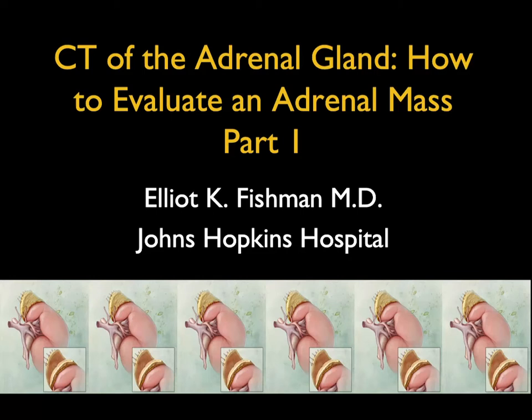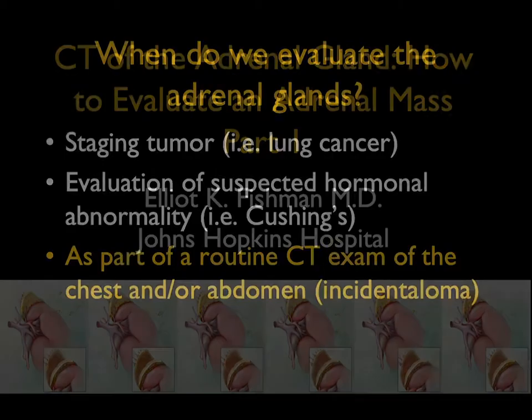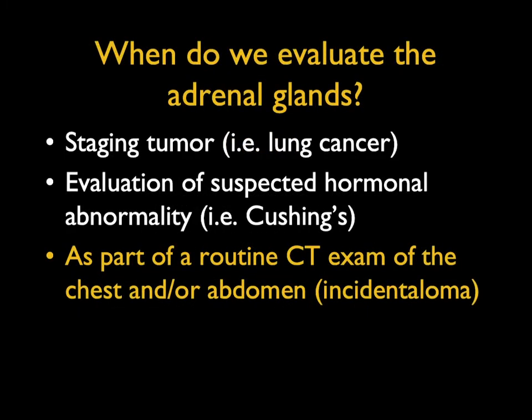This is going to be a series of talks on the adrenal gland, and let's get started. So, I've given talks on the adrenal glands before. You can see that on our iLectures or on CTisus, but this is updated. Now, the one thing that doesn't get updated is this slide, because it's true. Why do we evaluate the adrenals?